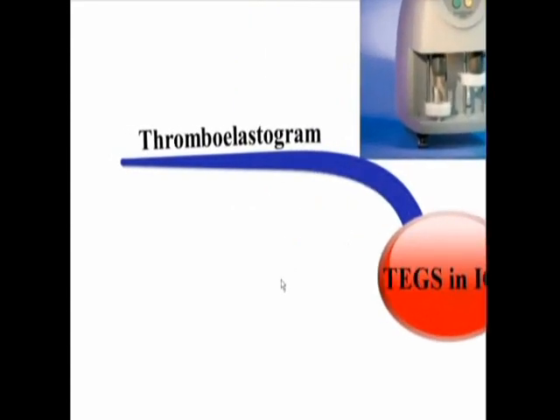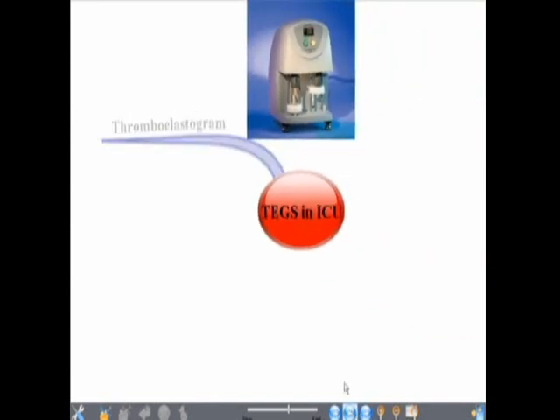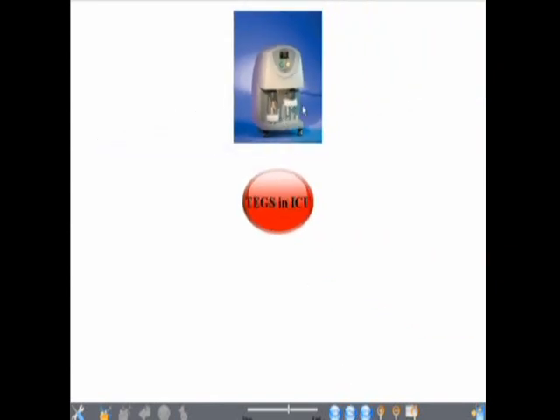This presentation is called TEGs in ICU, and basically I'm just going to start off with what does TEG mean? Well, TEG stands for Thromboelastography. And as you can see on the picture I've got over here, that's the machine over there, and it's called a thromboelastography.